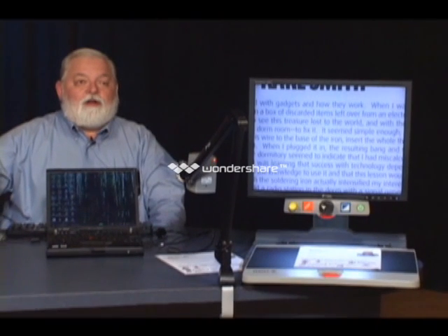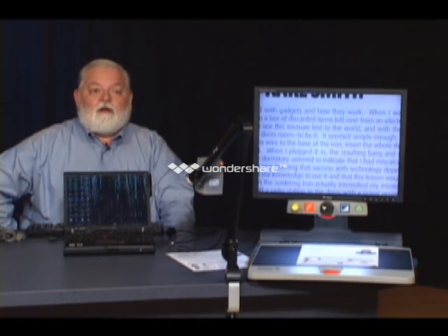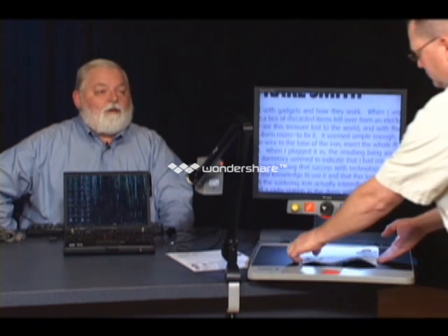And so it's really something you can try. These, again, are the most common ones. Frankly, the people that I deal with, I would say 90% of them prefer the black print on a white background, that high contrast. What you have to watch out for is when you're looking at pictures on this, go to my picture and put it over on white on black.